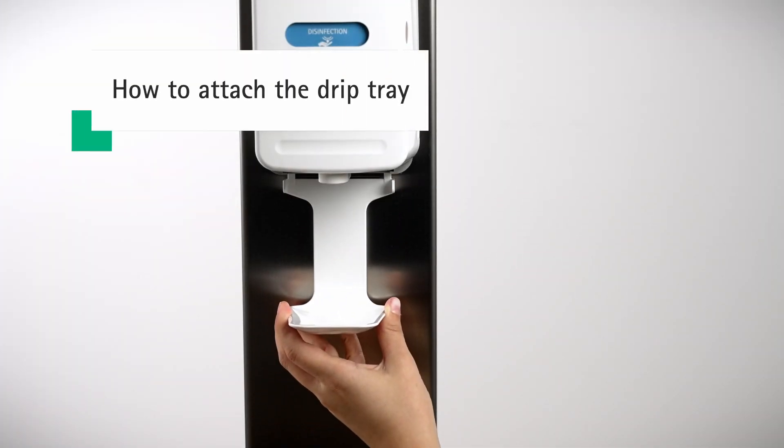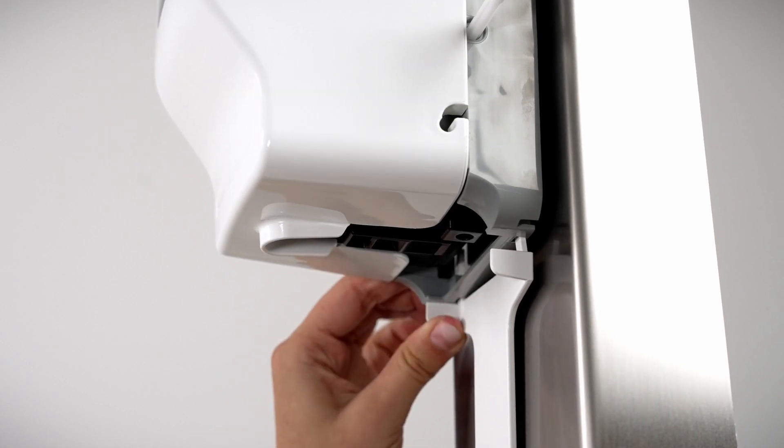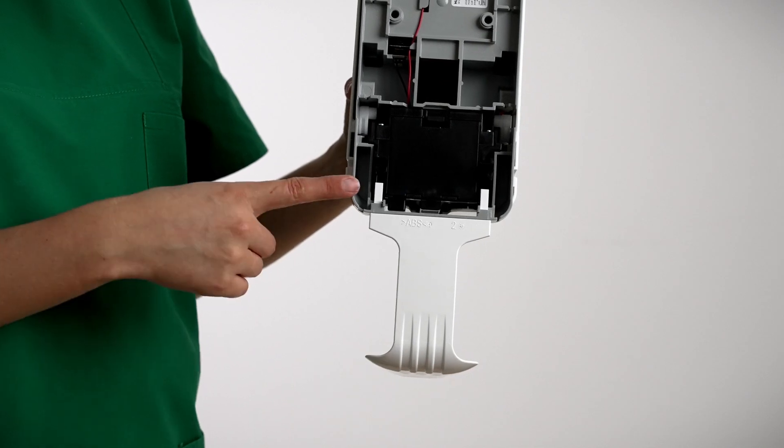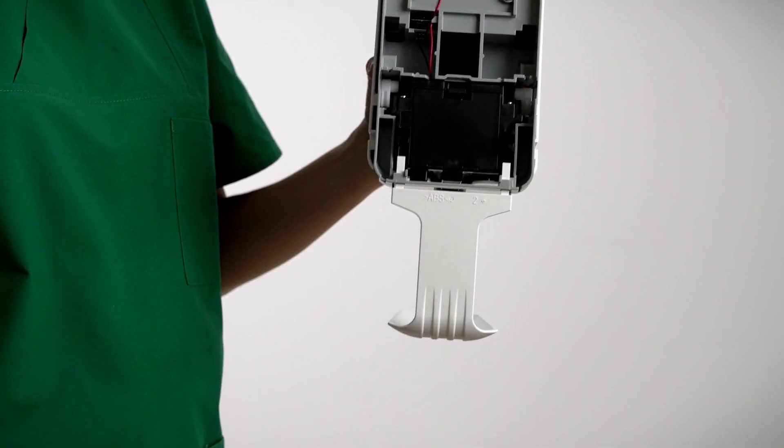To prevent liquid from dropping onto the floor, you can attach the optional drip tray. To remove the drip tray, press the white easy click-in knobs and pull the drip tray down.